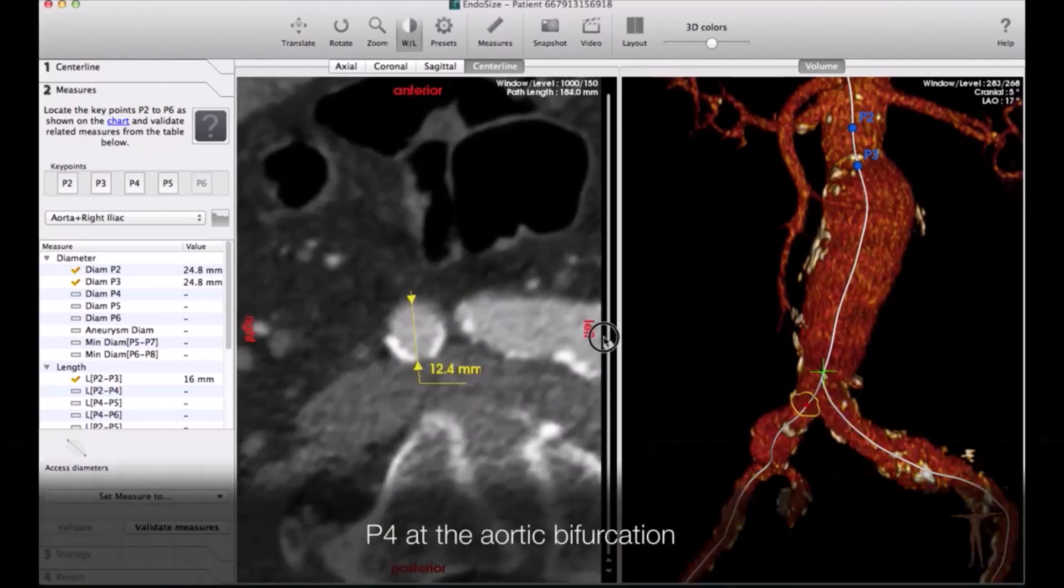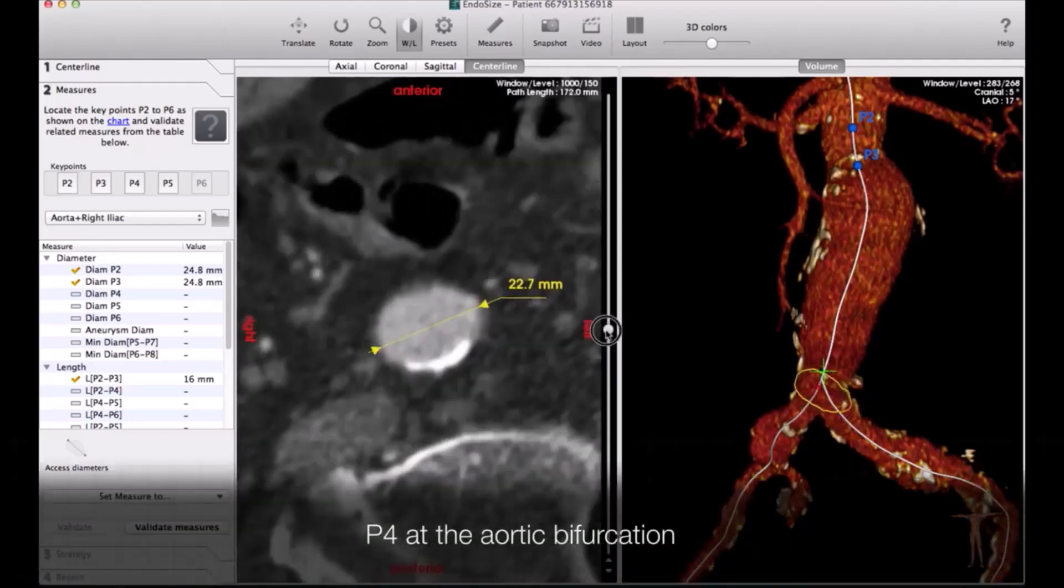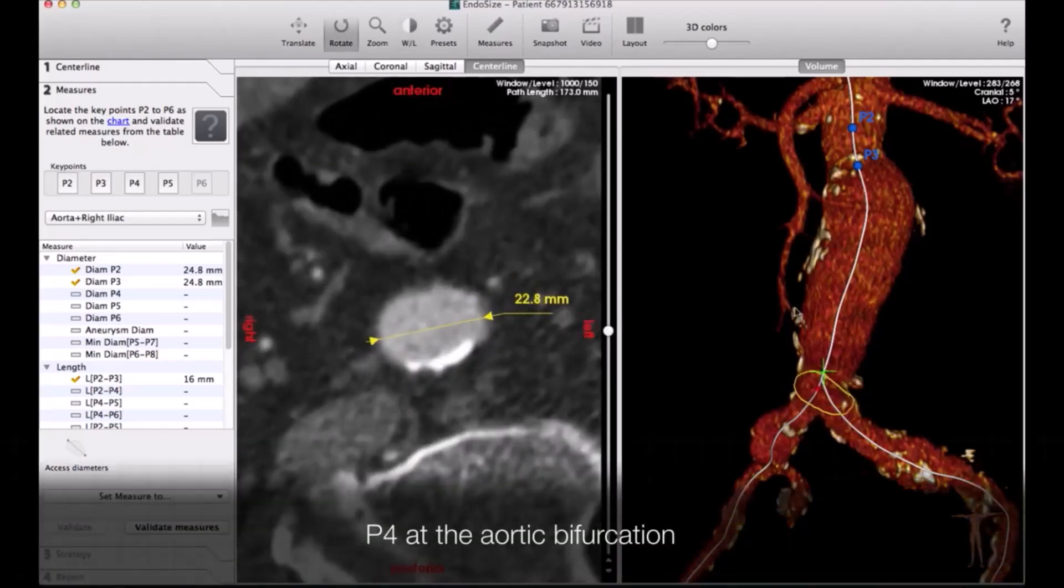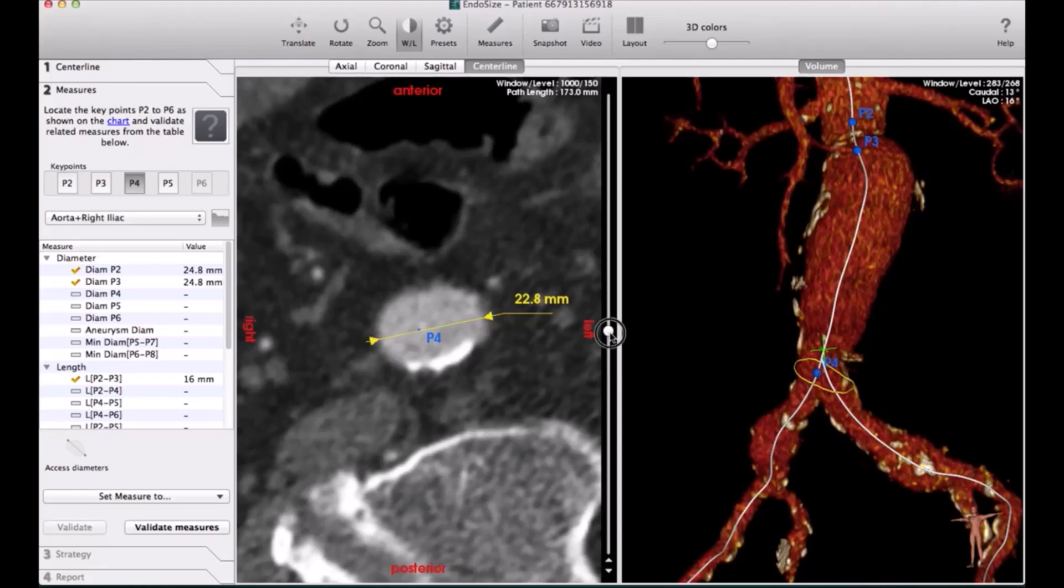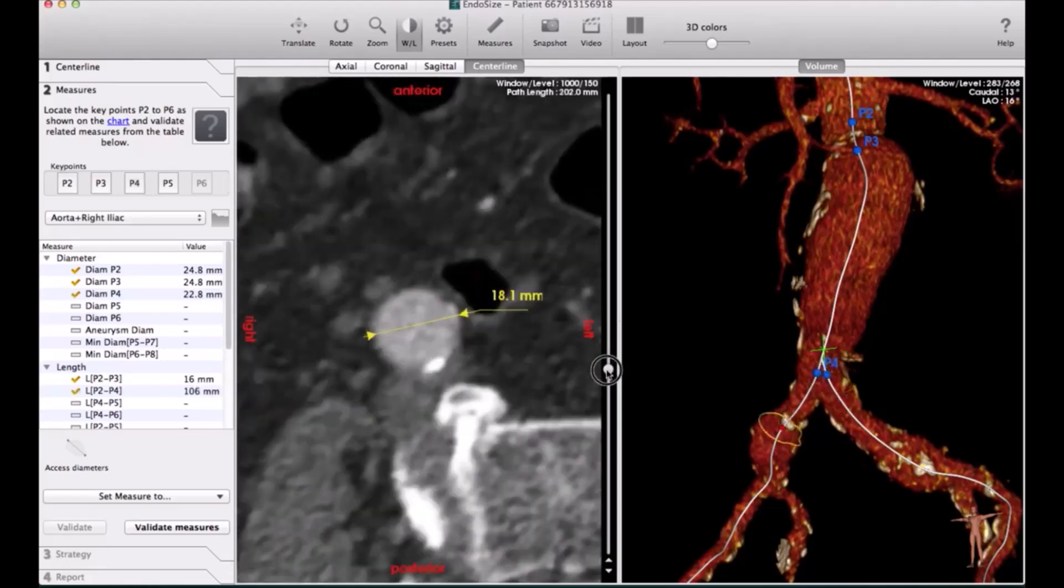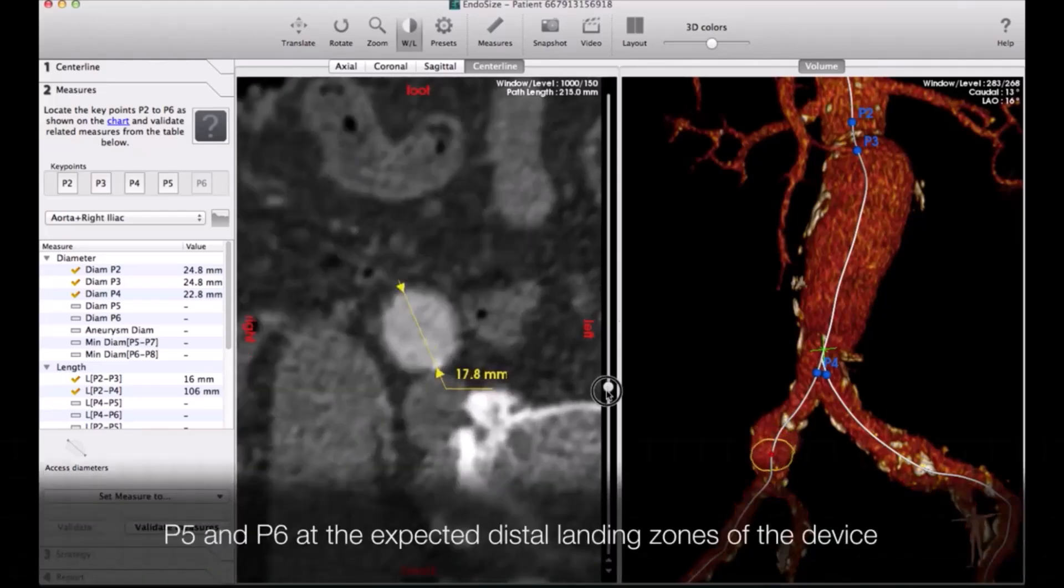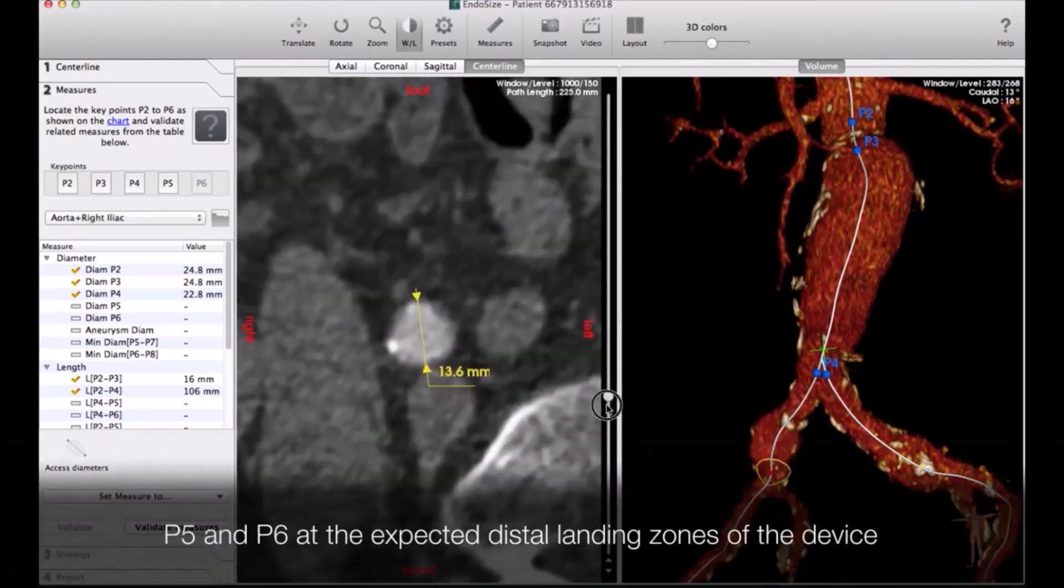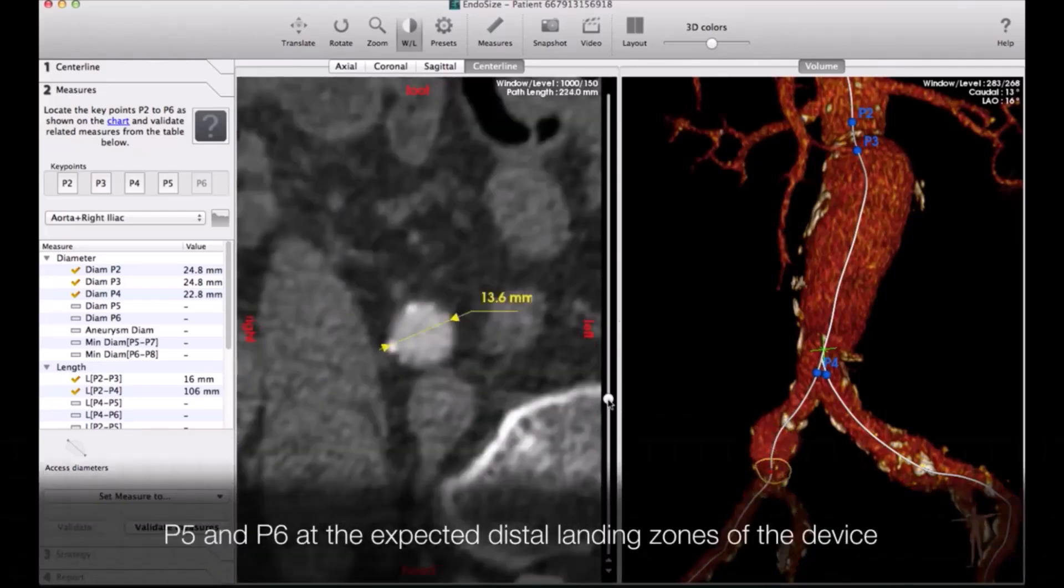Be very careful for the diameter inner-to-inner all the time when you go through. You need to decide your strategy, if you are going from the right-hand side or the left-hand side for this patient to do deployment.